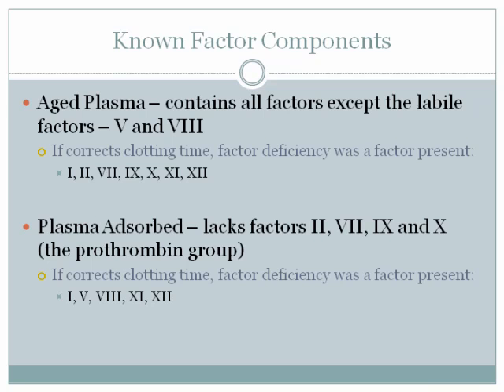What they have instead is an inhibitor. They have a circulating inhibitor. Something is messing up the results of these tests. So that would be the answer on this one. If you ever see this kind of case study, the answer would be a circulating inhibitor. So just so you're aware of that kind of a scenario.